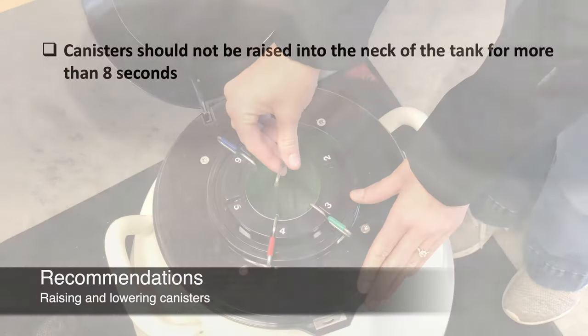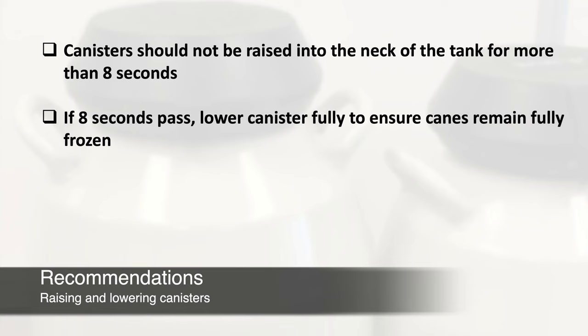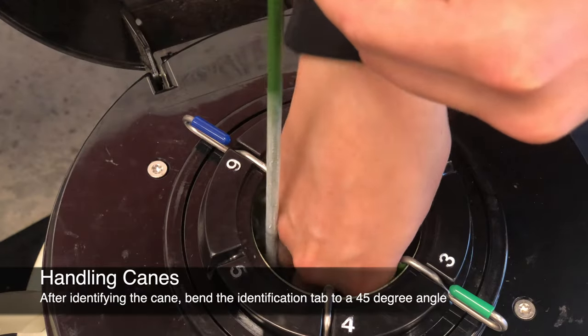We recommend that the canister should not be raised into the neck of the tank for more than eight seconds when removing straws or looking for the right cane. If eight seconds has passed, lower the canister back into the tank to ensure it remains fully frozen.